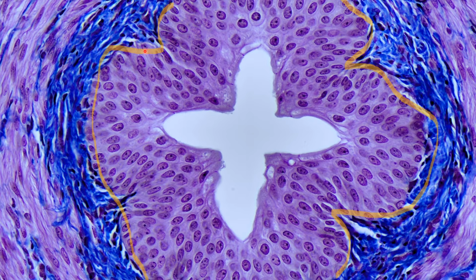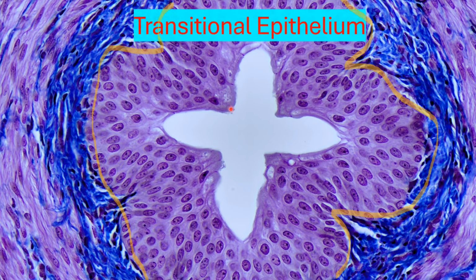So we can see there are multiple layers of cells, so it's some sort of stratified epithelium because we have a lumen here or an empty space. We look at the shape of the cells at the apical surface right here, and for the most part, they do vary. It's oftentimes described as scalloped, but this is what's known as a transitional epithelium because these cells, they're able to change shape. So this is of the ureter.